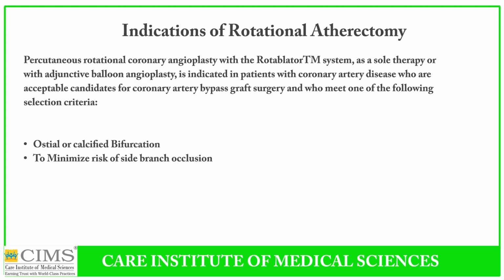Percutaneous rotational angioplasty with rotablator system as a sole therapy or with adjunctive balloon angioplasty is now indicated in these patients, mainly with ostial calcified lesions, bifurcation lesions, and it also minimizes side branch occlusion.